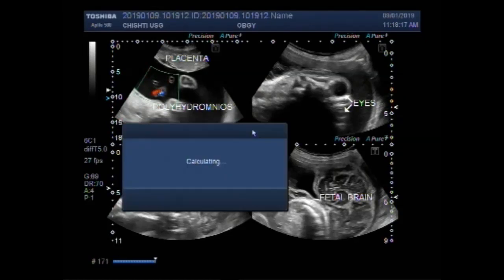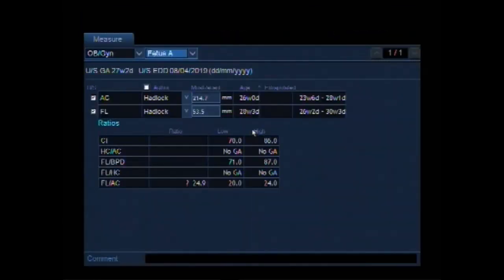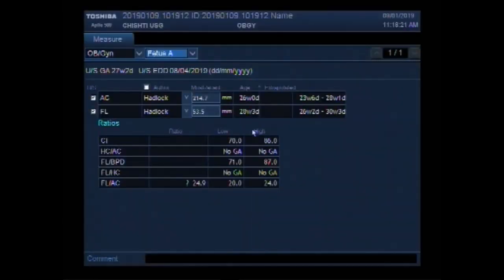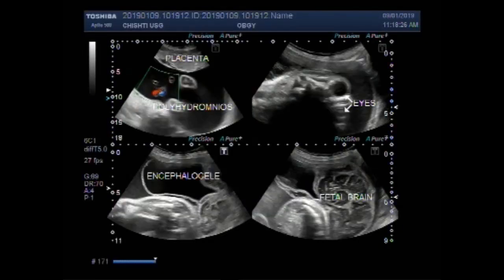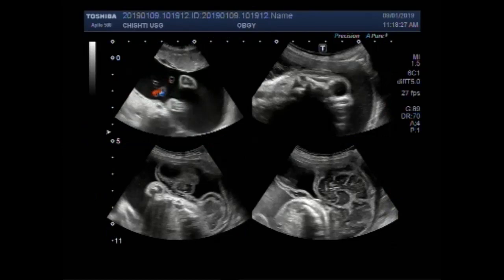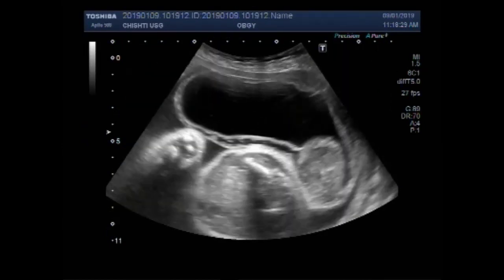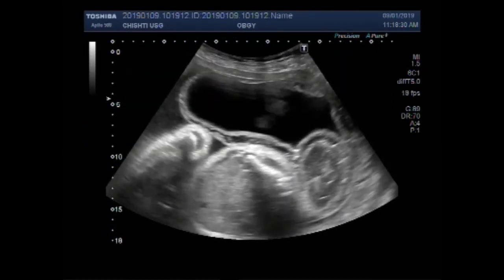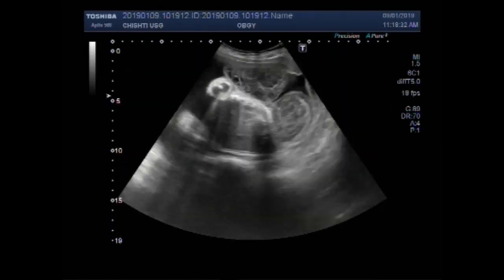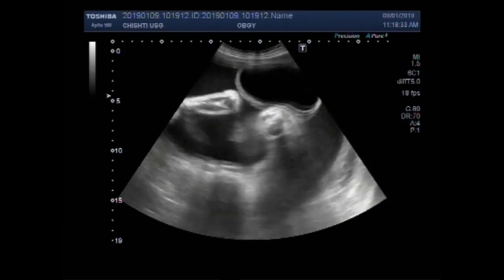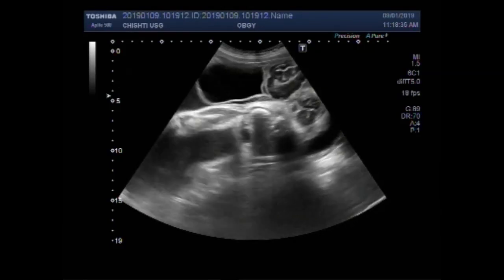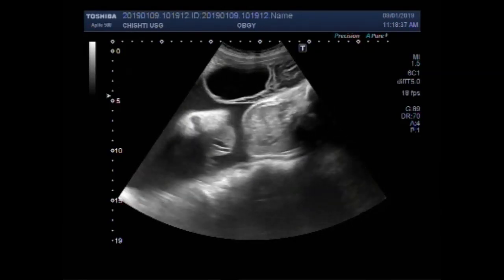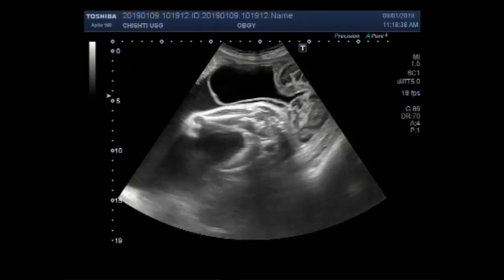These anomalies include an encephalocele, anencephaly, and polyhydramnios. You can see the fetus having an encephalocele.